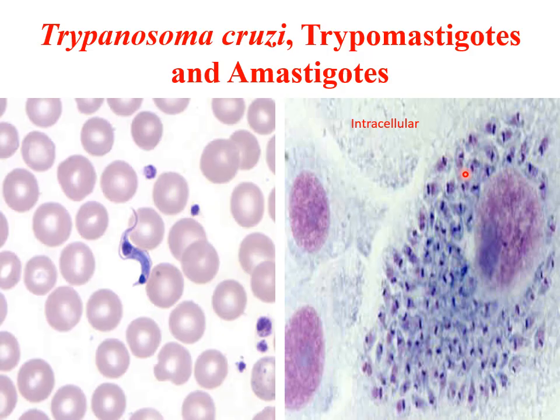And also I want to re-emphasize the fact that in Trypanosoma cruzi we see an additional stage, which is the amastigote non-flagellated stage. And again, if you see a biopsy of an infected tissue from Trypanosoma cruzi or Leishmania donovani, you are not capable of distinguishing the amastigote stages between these two parasites, and it will take you either going back to the history of the patient and the symptoms, or doing PCR with appropriate primers.